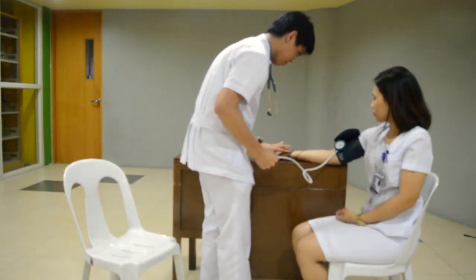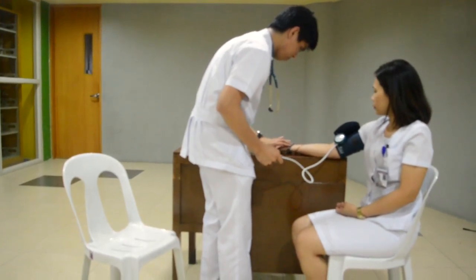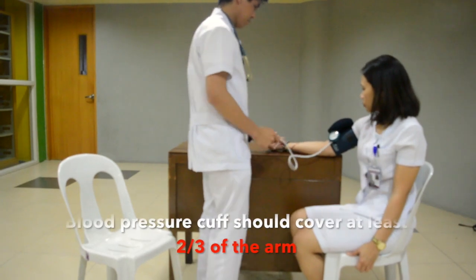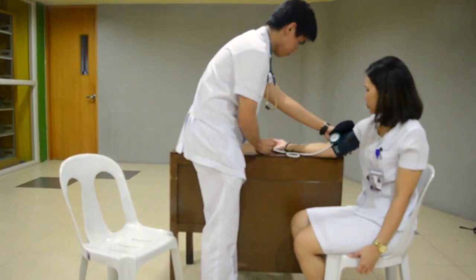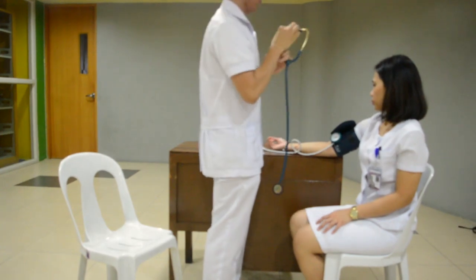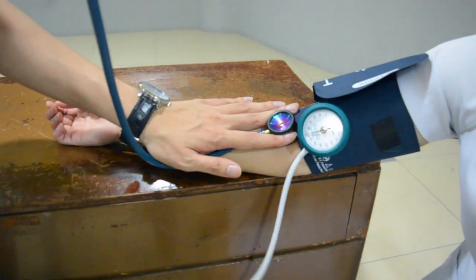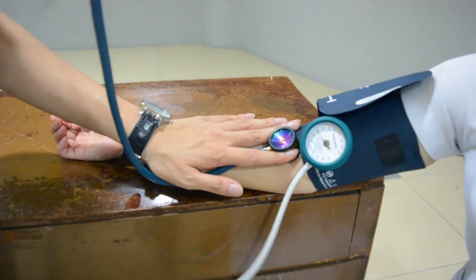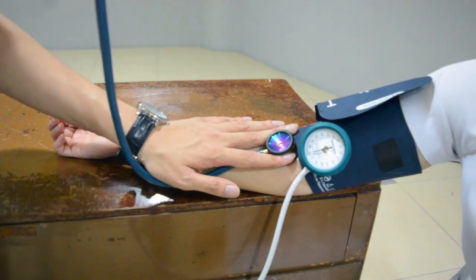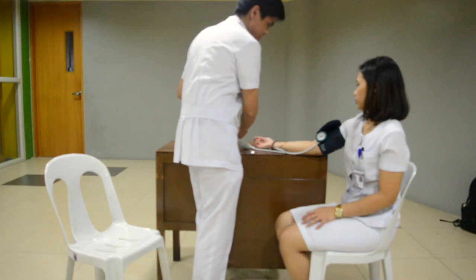You will need your skills in distraction and play. It is important to choose the correct sphygmomanometer cuff when measuring a pediatric patient's blood pressure. The cuff should cover two-thirds of the patient's arm, and cuff measurement varies by the patient's age. Lightly press the stethoscope's diaphragm over the brachial artery just below the cuff's edge. Rapidly inflate the cuff, then release air at a moderate rate. The first knocking sound is the systolic pressure, and when the knocking sound disappears, that is the diastolic pressure.